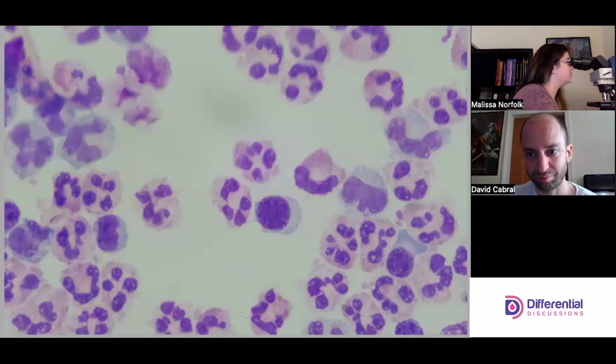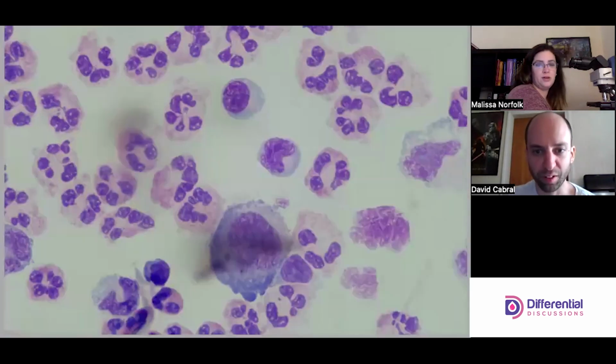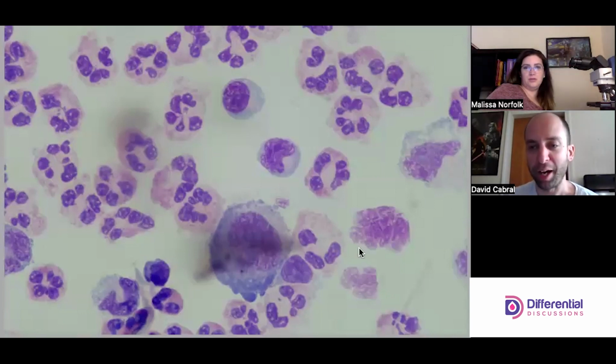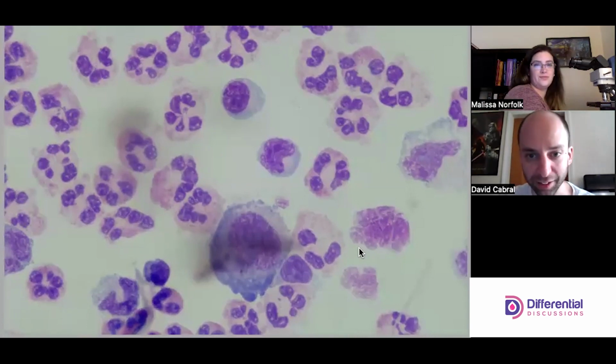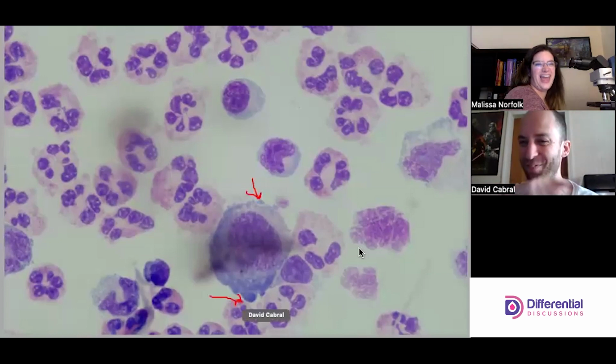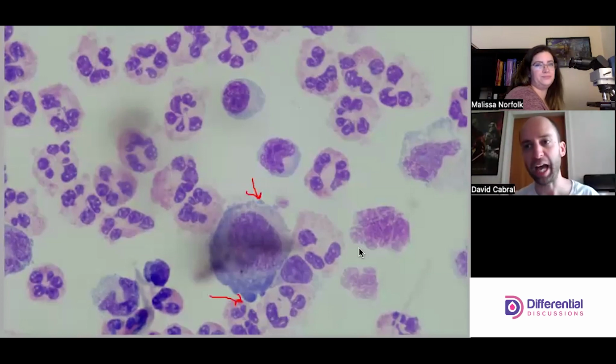Well, I don't see anything too exciting. I was looking to see if there were any lining cells, or a big ugly cell there underneath. Unfortunately, it's a shame, because that looks like it might be a good lining cell. There's something shadowing it, so it's tough for us to look at the nucleus. But remember when Melissa talked about the rough edges? This is exactly the type of feature. I'm trying not to point at the neutrophil, the blue cell, but those little blebs and some of that roughness speak to it being likely a lining cell, a tissue cell.